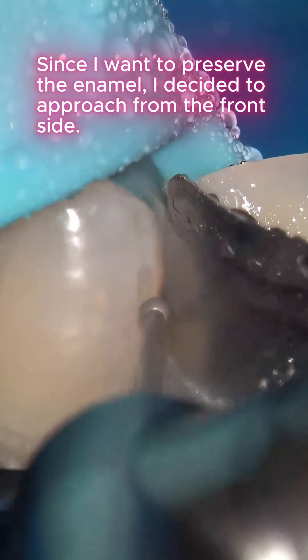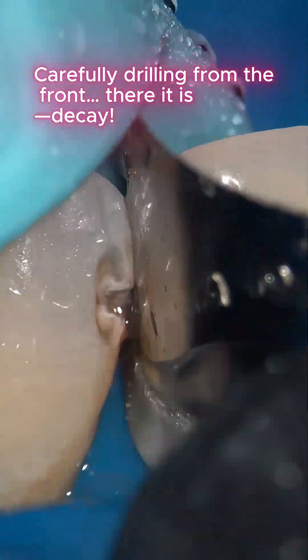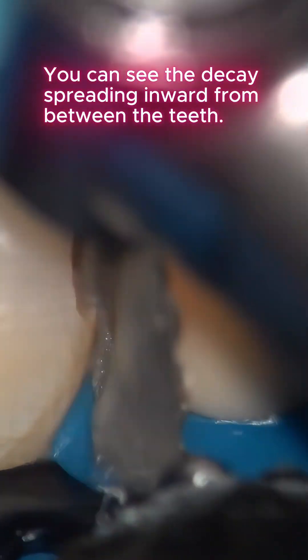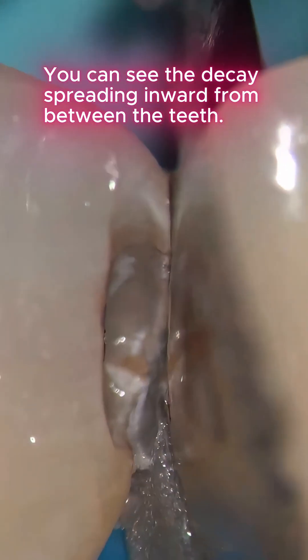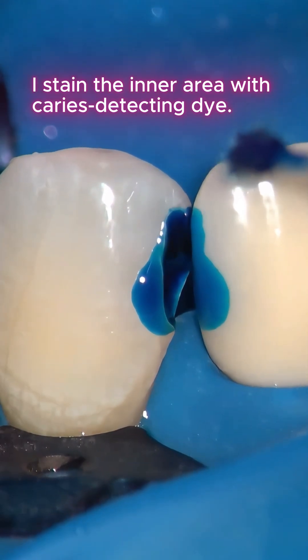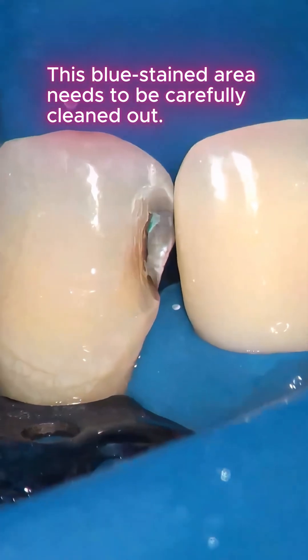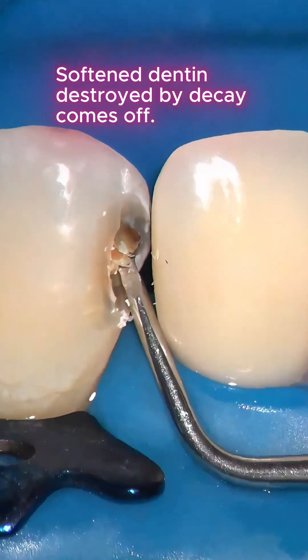Carefully drilling from the front — there it is. You can see the decay spreading inward from between the teeth. I stain the inner area with caries detecting dye; this blue stained area needs to be carefully cleaned out.